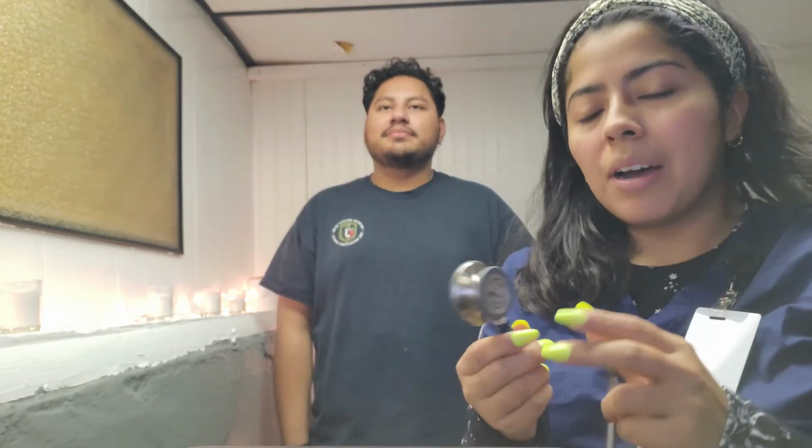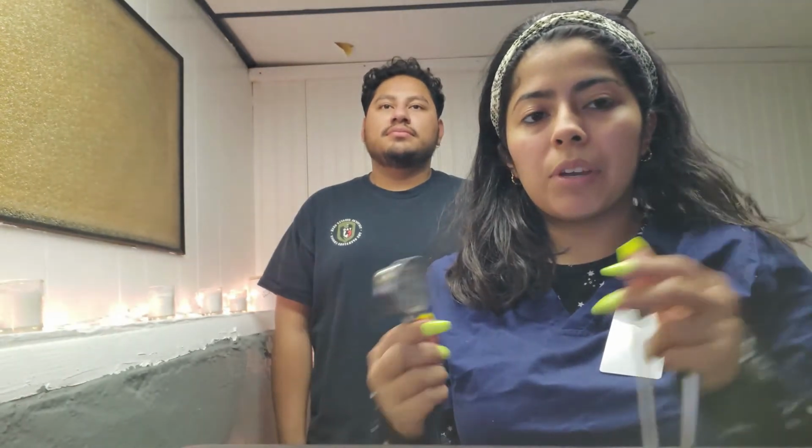In this assessment, we're going to be using the stethoscope, and the stethoscope actually has two parts. It has the diaphragm, which is the flat part that you usually see doctors using, and then the bell part, which can actually be moved, which I didn't know. But for this assessment, we're going to be using the diaphragm.